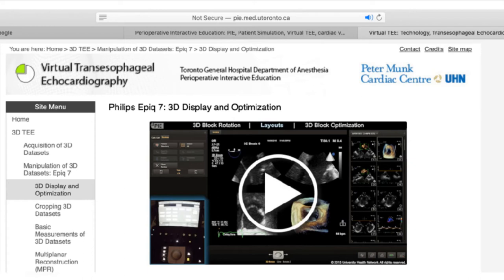Here we're looking at the mitral valve from the atrial side. There's a feature that allows us, whenever we get lost, to go back to where the block started - that's the home button. We can also look at this same block from two perspectives at the same time - this is called dual volume layout. Here we see the mitral valve from the atrial side and at the same time from the ventricular side. We take the block, flip it, and display it simultaneously.